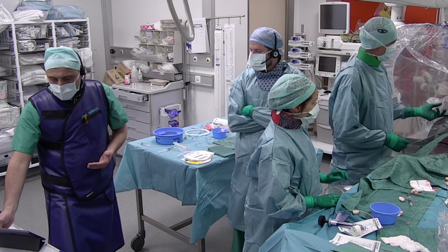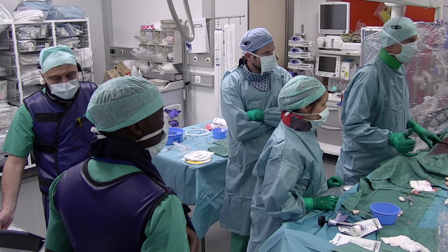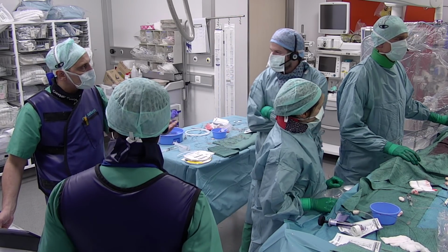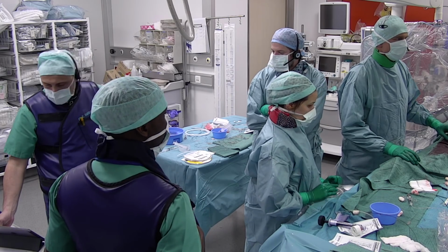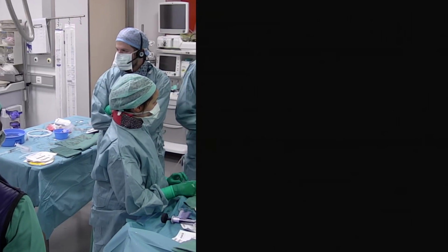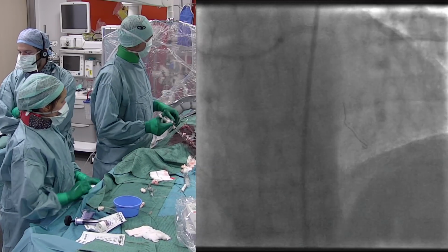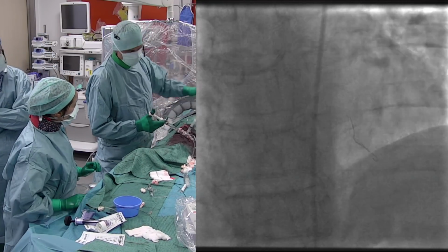One of the first comments asked by a colleague: I think there was no doubt that this left main was seriously diseased, so probably there was no need to do imaging or function. This is, of course, a good comment, but I would say this comment pertains to the situations where colleagues just do not have at their disposal all these tools. So what is your practical advice here?